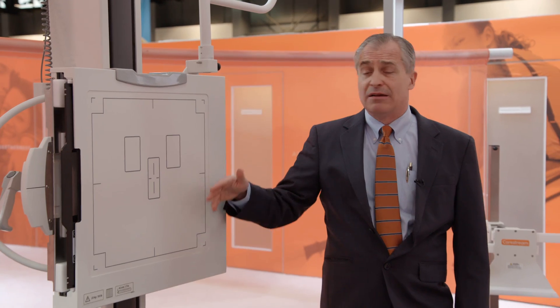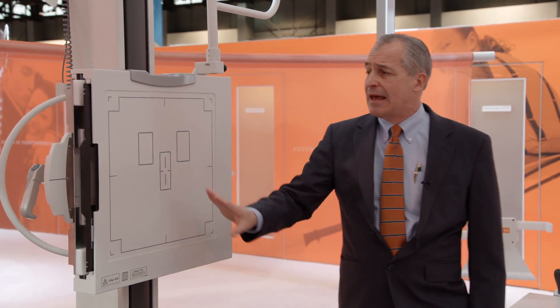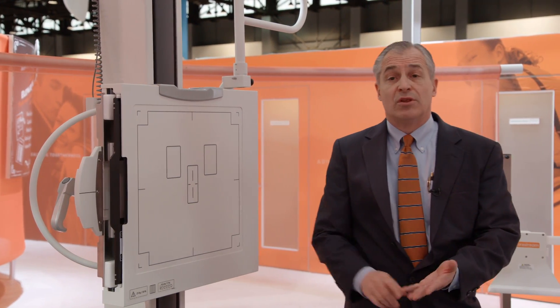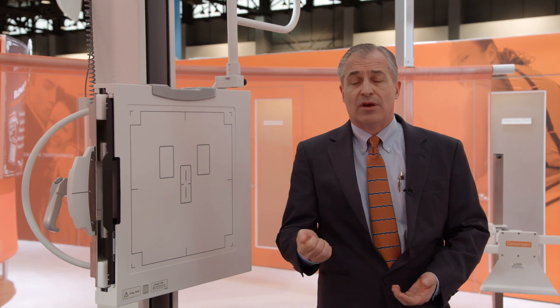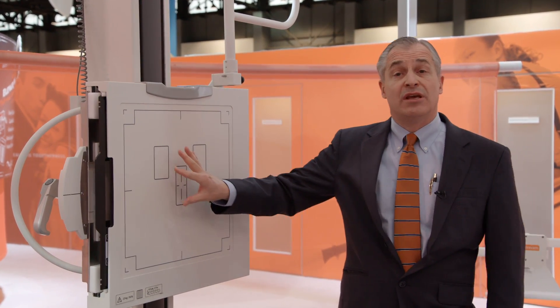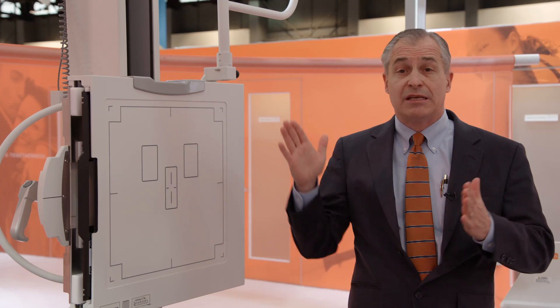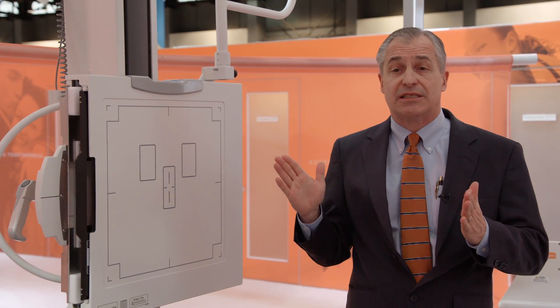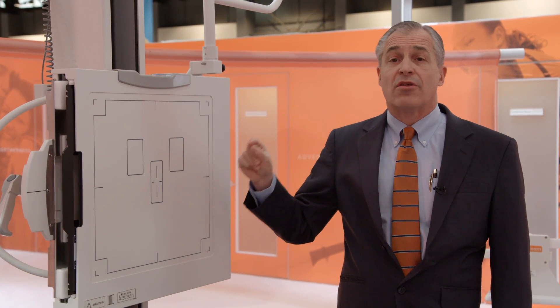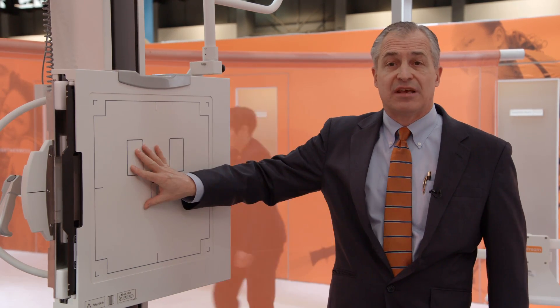Coming over here, we also have a wall stand. We have many flavors of the wall stand — this is the plain wall stand, and we also have a tilt version. It has a full complement of bucky trays, as does the table. You can get it with the rotating tray for the detector, traditional analog buckys, as well as the intermix bucky, which allows you to put both a 17x17 or 43x43 centimeter detector, and also a 14x17 or 35x43 centimeter detector in the same bucky.